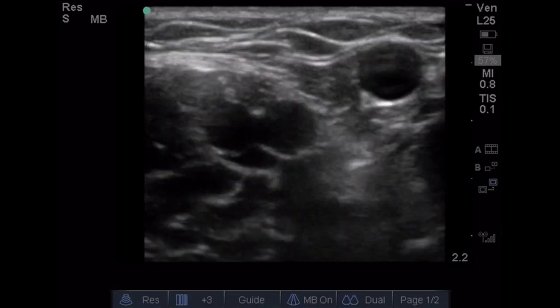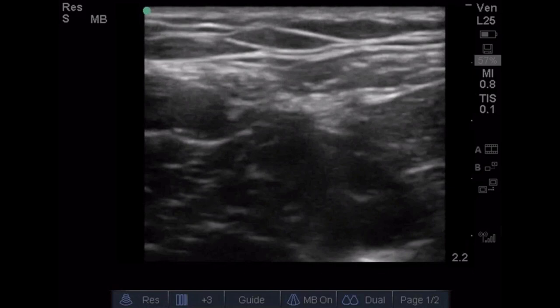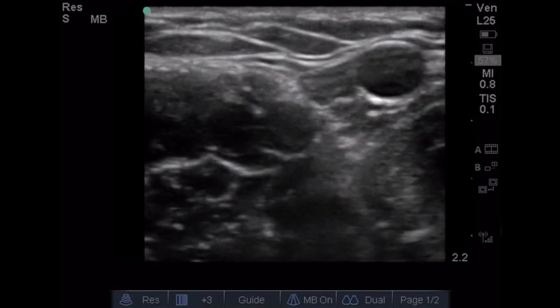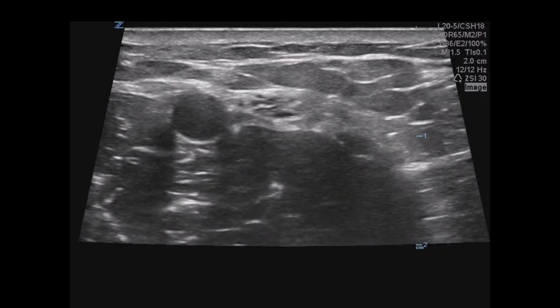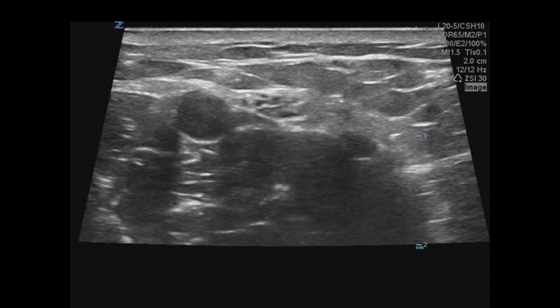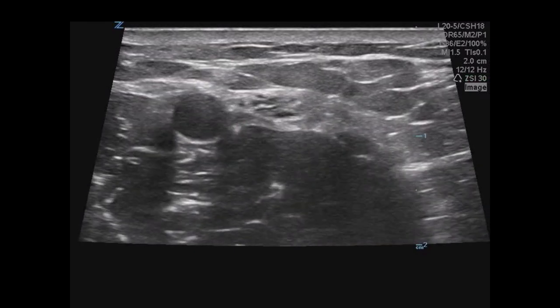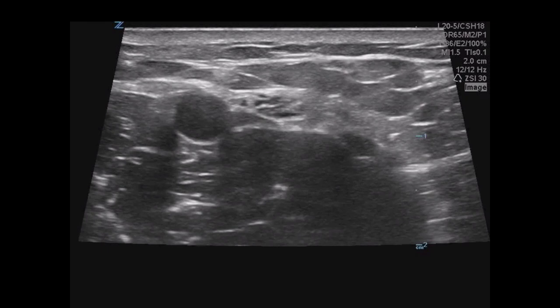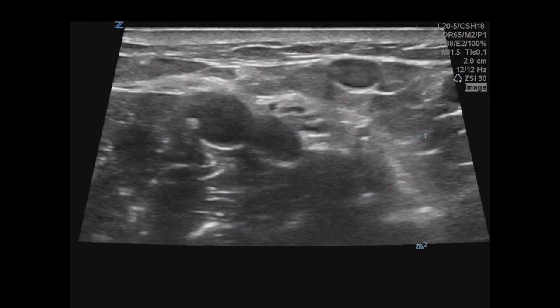A caveat: if your patient is profoundly hypotensive with very low arterial pressure, you may be able to compress the artery. Another way to differentiate is pulsatility — when you begin compressing the vessels, the veins collapse and you can note the pulsatility of the artery. You can see the brachial vein compresses while the paired artery next to it shows pulsatility.